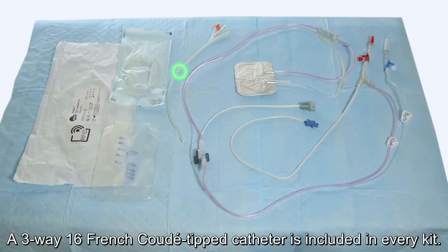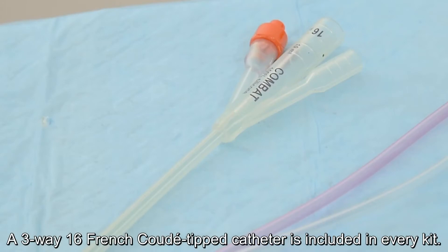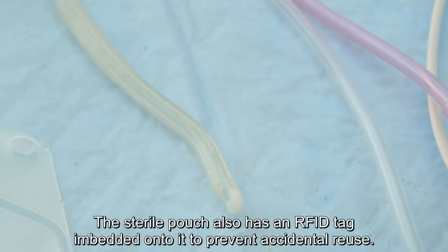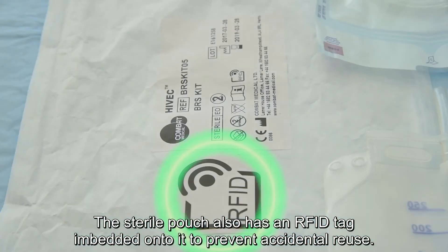A three-way 16 French coude tipped catheter is included in every kit. The sterile pouch also has an RFID tag embedded onto it to prevent accidental re-use.